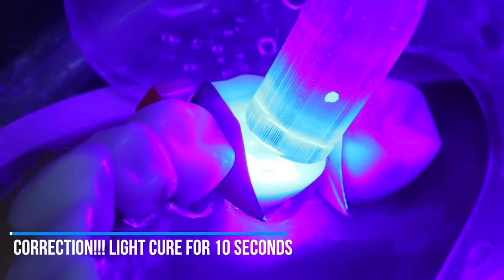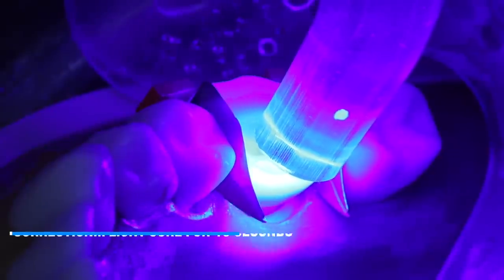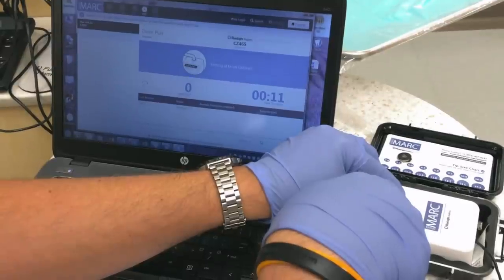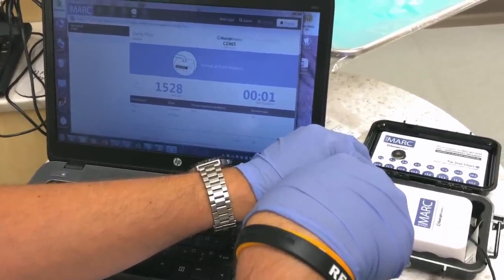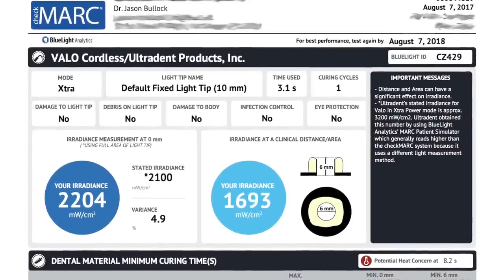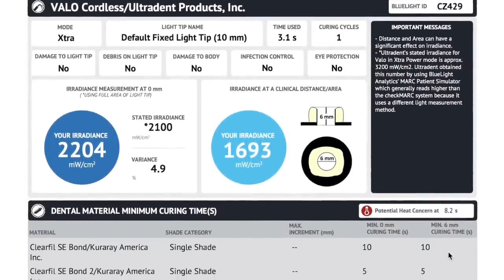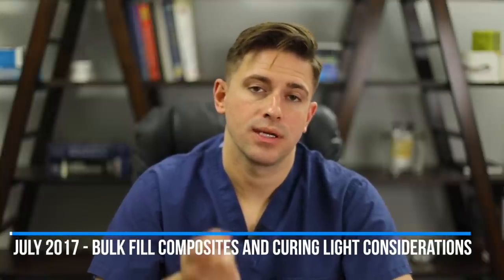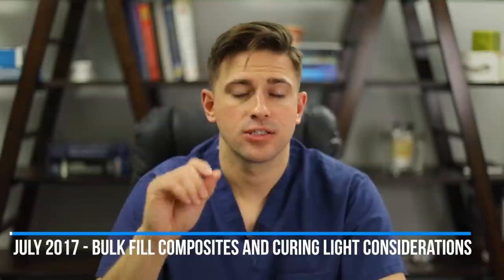How long you light cure depends on your curing light — if you're using a high-intensity light, use your normal curing duration for your bonding agent. I have a separate video on curing lights where I discuss the checkmark system, a tool developed by 3M and Blue Light Analytics that tests your curing light and gives recommendations on cure times based on the materials you use. Check that out in Evidence-Based Quarterly 2017.